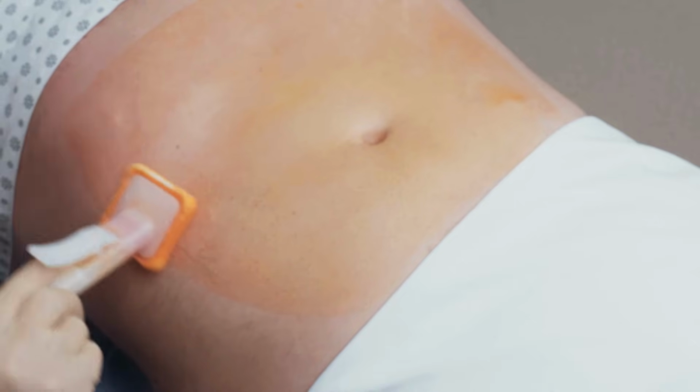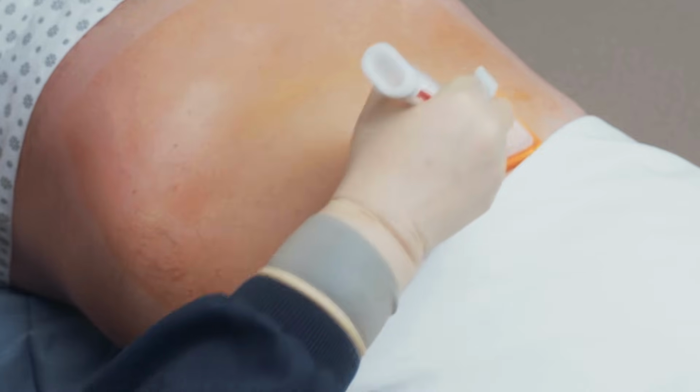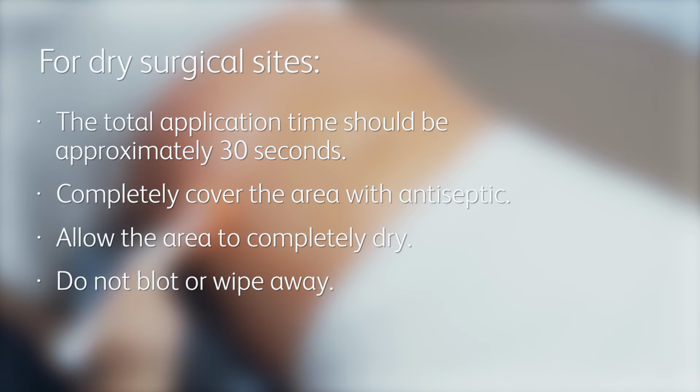For dry surgical sites such as the abdomen or arm, use gentle, repeated back and forth strokes of the sponge for approximately 30 seconds. Completely wet the treatment area with antiseptic. Allow the solution to completely dry without blotting or wiping away.